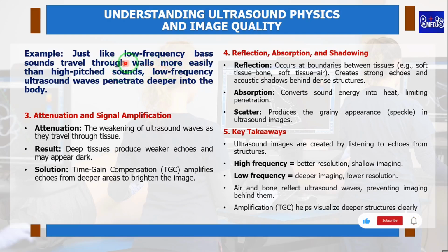This is because low frequencies travel deeper through structures. So you can hear a bass sound from a very distant location more than sounds with higher pitch. So lower frequency ultrasound waves penetrate deeper into the body. That's just what this is trying to explain to us.